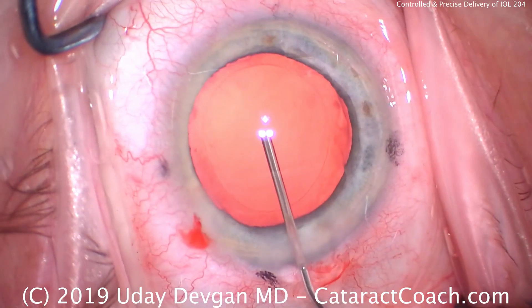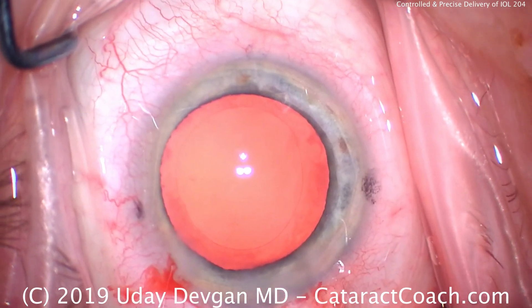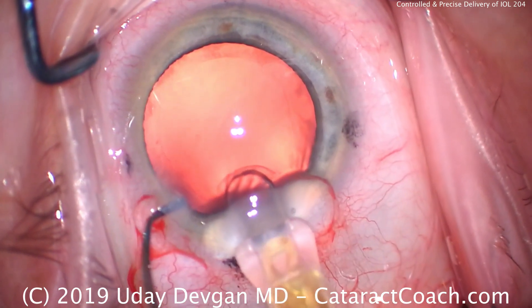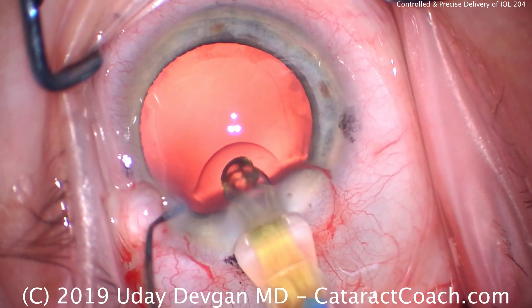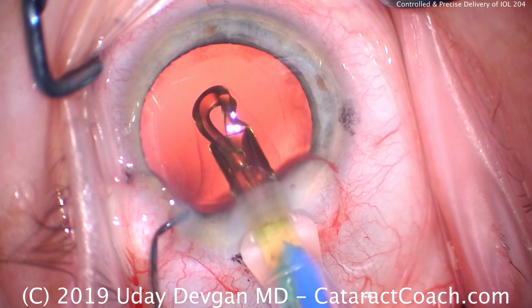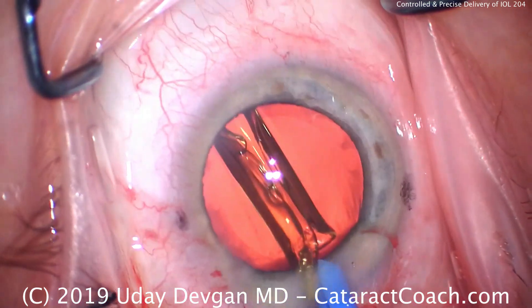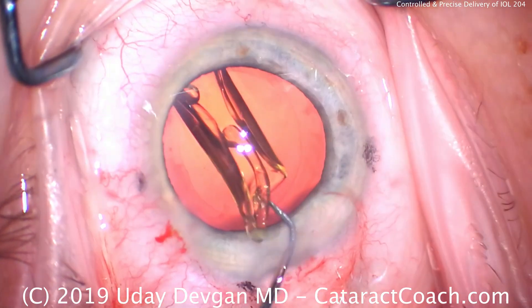Here's where we're filling the capsular bag with our cohesive viscoelastic. There's the capsulorrhexis, and here comes the lens — this has been loaded by my expert technician. Look how slow and controlled we can deliver this. This video is shown in real time. Look at the envelope of viscoelastic around the IOL. There it goes — it's exactly where I wanted: the leading haptic and optic edge under the nasal capsulorrhexis.